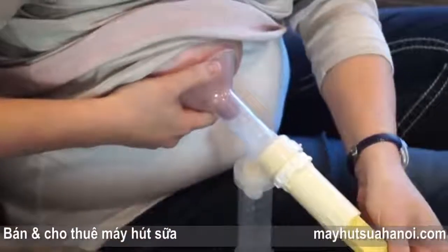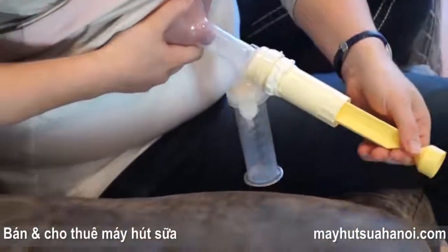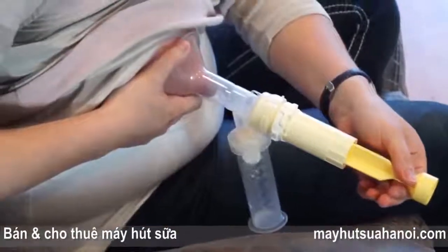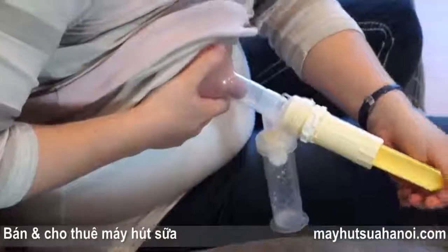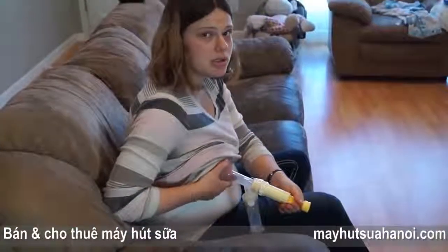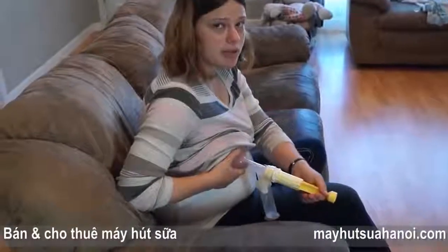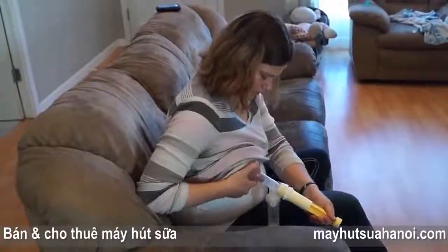Once the milk starts flowing, it's usually good not to watch it. It can be stressful to think you're getting a lot and look down and see very little in the bottle. And remember that if you're just starting out pumping, your body's still getting used to the pump, you might not produce much at first, but if you do it regularly every day around the same time, you'll be able to produce more as time goes on.